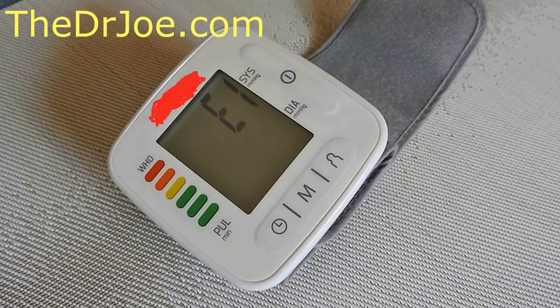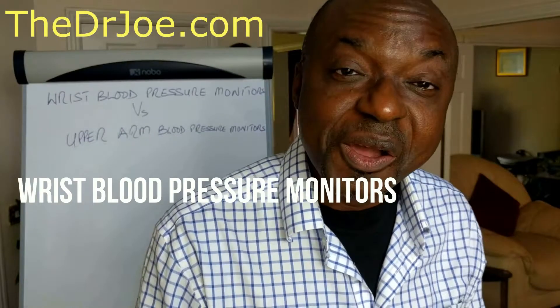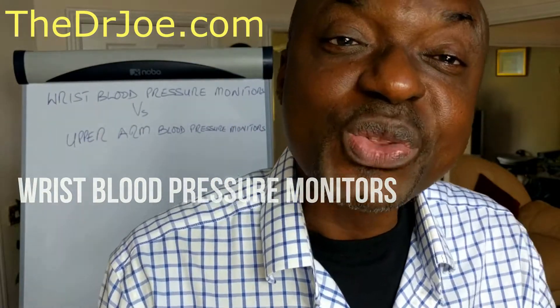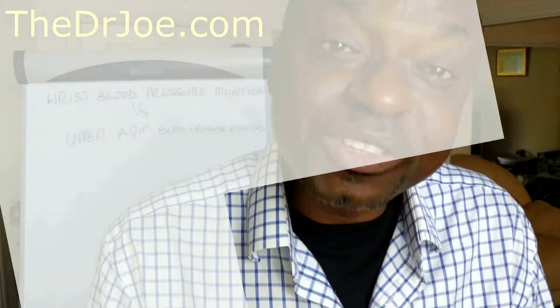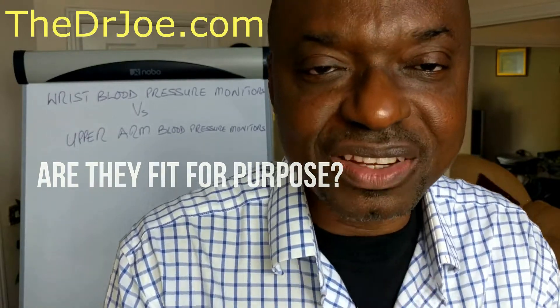Hello! Wrist blood pressure monitors have actually grown in popularity in the last couple of years. But the question is this: do they actually do what they are designed for? That is to say, do they give you accurate blood pressure readings? That's what this video is about.